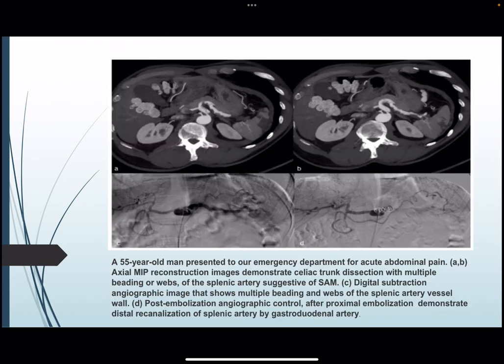A 55-year-old man presented to the emergency department with acute abdominal pain. Axial MIP reconstruction image demonstrated celiac artery dissection with multiple beading or webs of the splenic artery, suggestive of segmental arterial mediolysis. Digital subtraction angiography confirmed multiple beading and webs of the splenic artery vessel wall. Post-embolization angiographic control after proximal embolization demonstrated distal canalization of the splenic artery by the gastroduodenal artery.